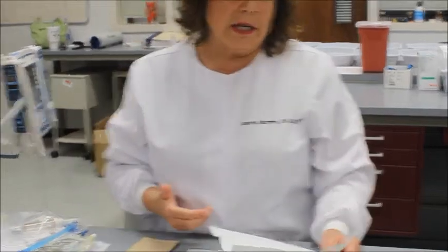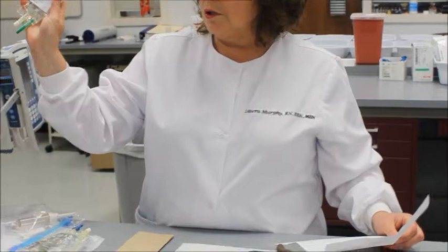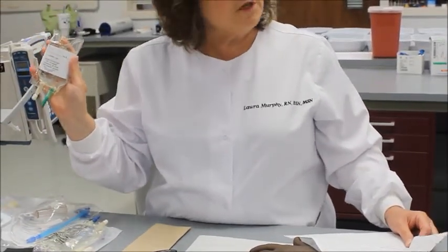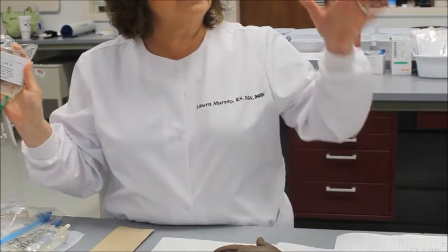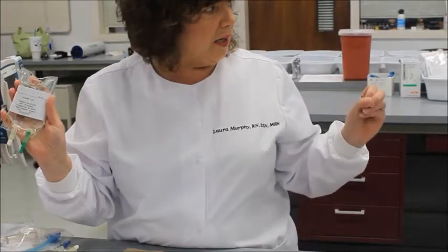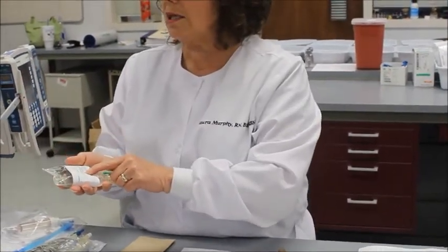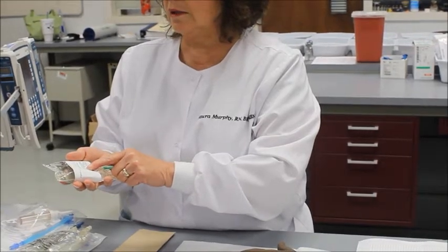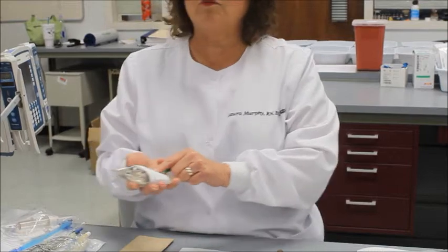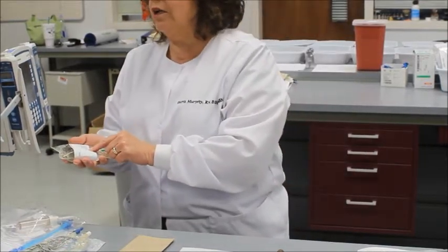With your secondary medications, there is an amount to be infused and there is a minimum infusion time. The minimum infusion time is the fastest that it can go in. We can make it go in slower. So the minimum infusion time on this is 35 minutes. 50 can go in 35 minutes. So can I run it in 30 minutes? No. Can I run it in an hour?